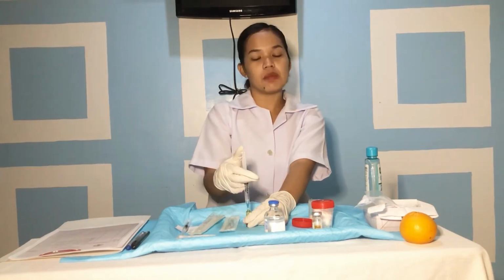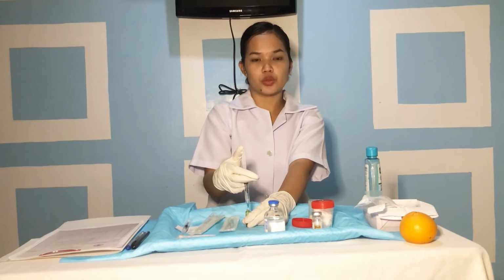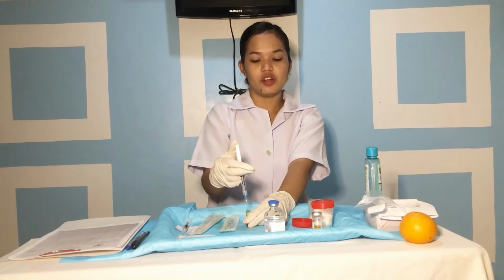Keep the needle tip under the surface of the liquid. This will prevent aspiration of air bubbles. If air bubbles are aspirated, do not expel air into the ampule, because air pressure forces liquid out of the ampule and medication is lost.